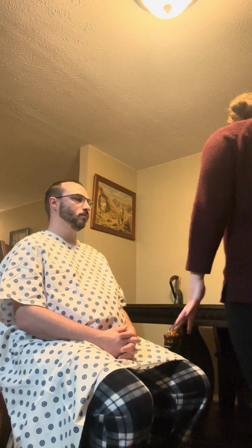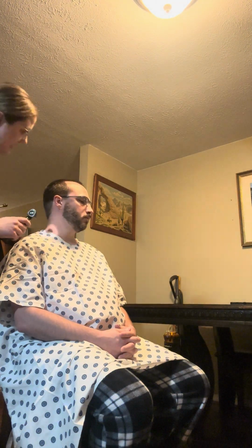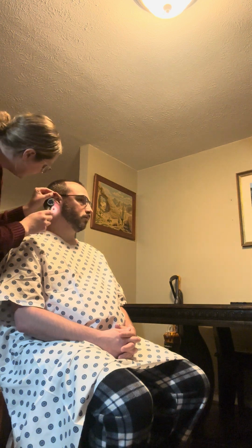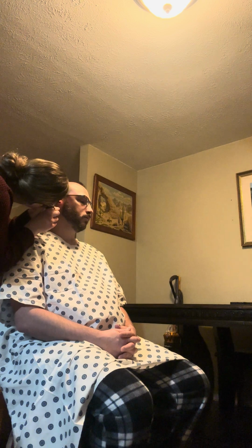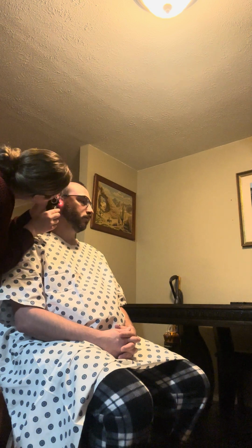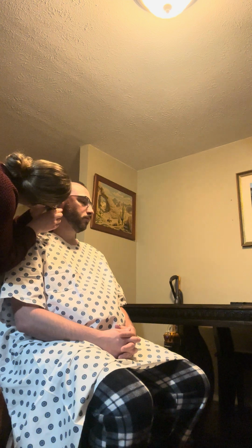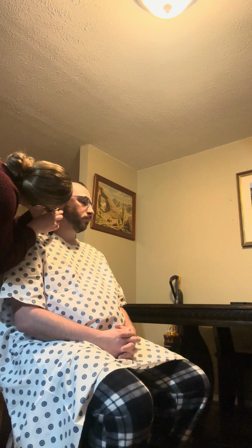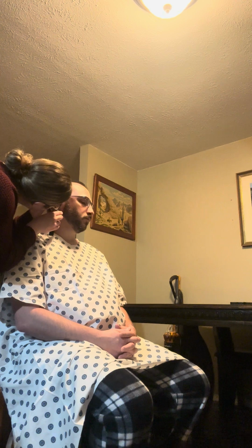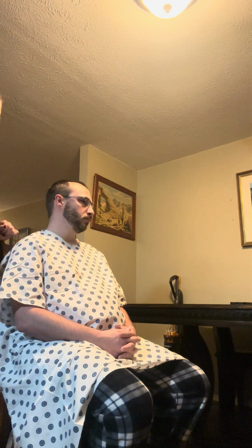Since there is no pain or tenderness, I am going to take my light source and examine the internal structures of the ear, sorry, and I will start on the right ear. And just taking a look, I'm going to pull the pinna up and back, and I'm looking into the eardrum. The ear canal is pink and patent. There is cilia present. There is a small amount of cerumen, but I can still see past it. And the ear canal is pink, patent.